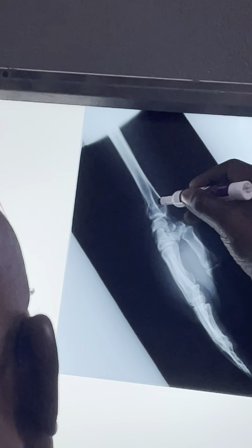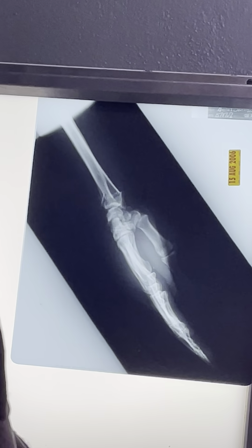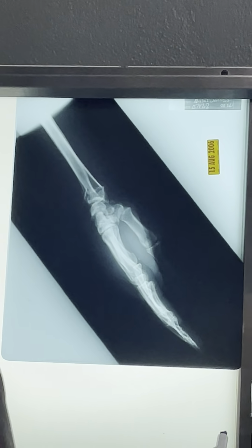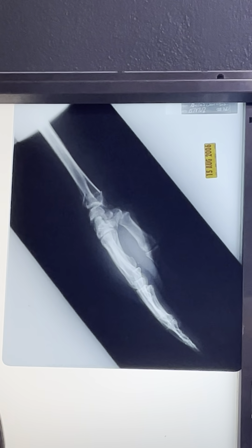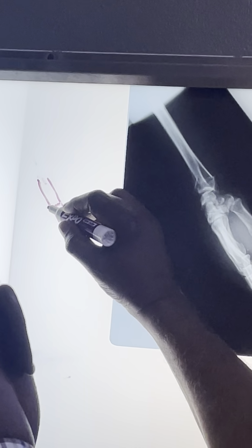So let's do a perfect reduction. You see that? You see how you will see the cortex over there if it's in the same plane of alignment, like how you're not seeing the cortex over here. Agree? So you know right away, if you're seeing the bone not in the same anatomical alignment, there had to be some rotatory deformity. When you reduce the fracture, you want to go back to what was normal. So that's equivalent to normal.